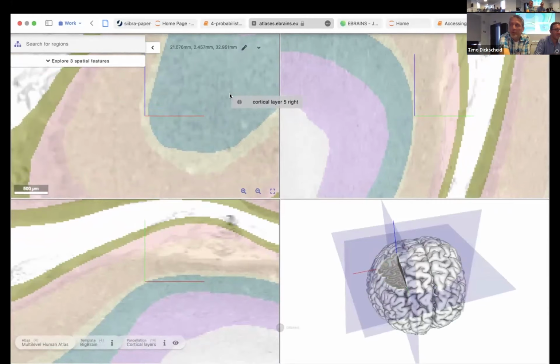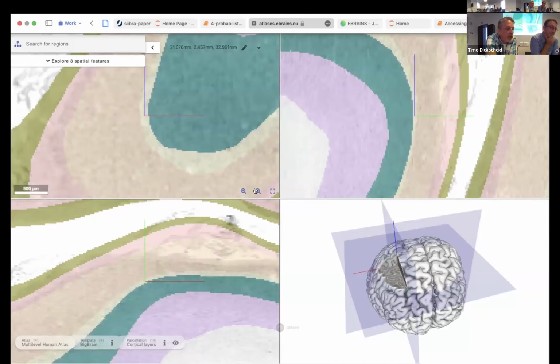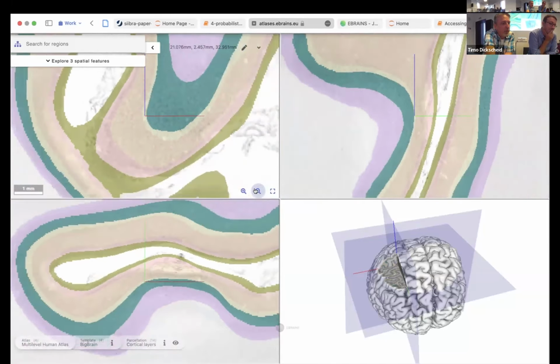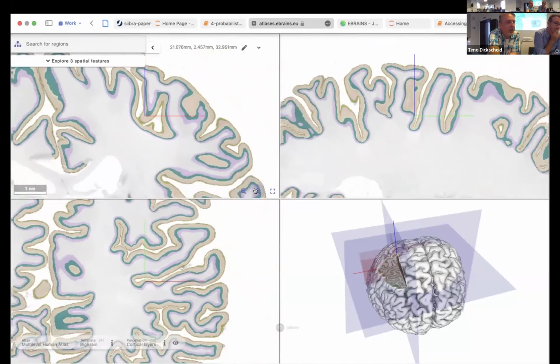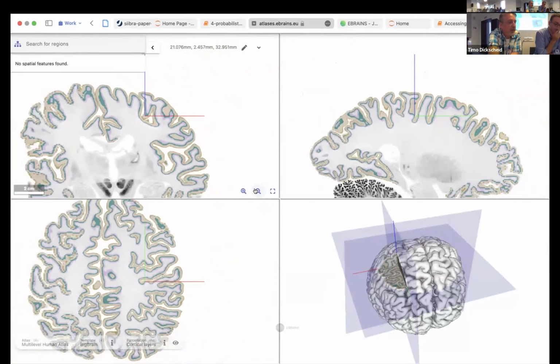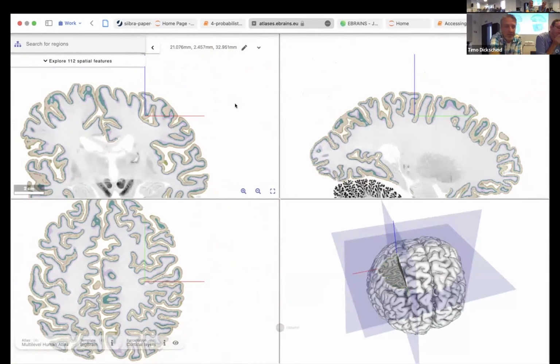So this is the BigBrain, which consists of 7,000 sections with 20 micrometer in-plane resolution, and here, maybe to give you an overview, it's like in the viewer before. We have different cutting directions. So here is the original frontal cut direction of the BigBrain, and those are the reconstructed cutting directions of the BigBrain. So those are completely virtual. This is the only real existing cutting direction, and those were reconstructed.